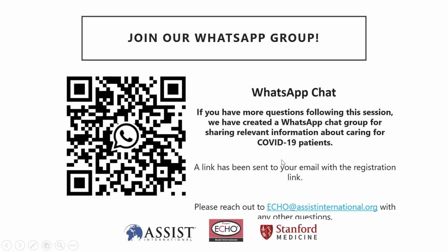For example, some people might think that if you are running out of oxygen, then using a nasal cannula at a higher liters per minute would save more oxygen than using a non-rebreather, but in fact it will waste more oxygen if you have a nasal cannula at 10 liters per minute compared to a non-rebreather at 10 liters per minute, because the nasal cannula doesn't have the bag to create a reservoir. So by properly using all the devices, as Dr. Crawford laid out in the device section, you're actually more likely to save oxygen. It's a great point.